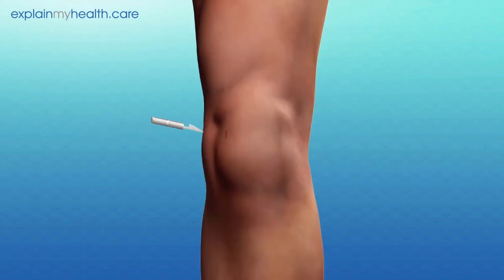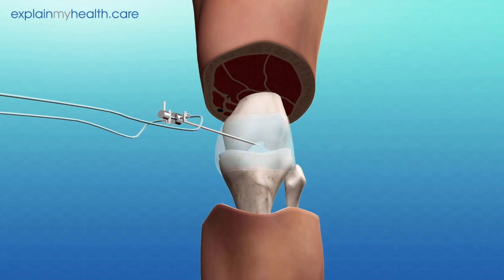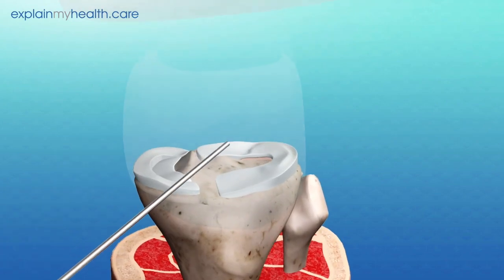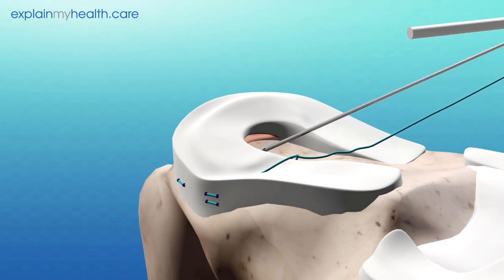This keyhole operation involves making small cuts around the joint to insert a camera and instruments. The joint is filled with a saltwater fluid to expand it and create room for the surgeon to operate. The joint is visualized using a keyhole camera, and the torn cartilage is secured back into place with stitches.